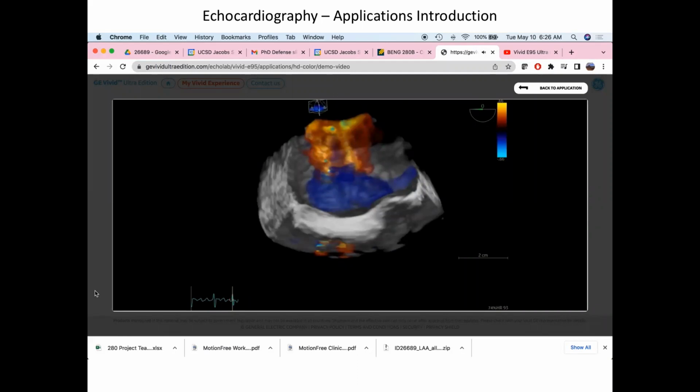The other interesting aspect of that is, and we run into this in CT a lot, say, well, I can do single heartbeat imaging, therefore I am protected from artifacts from atrial fibrillation. However, you have to then ask, what type of heartbeat did you image? Now I've got a whole collection of heartbeats that this patient can deliver. Which one did we image?